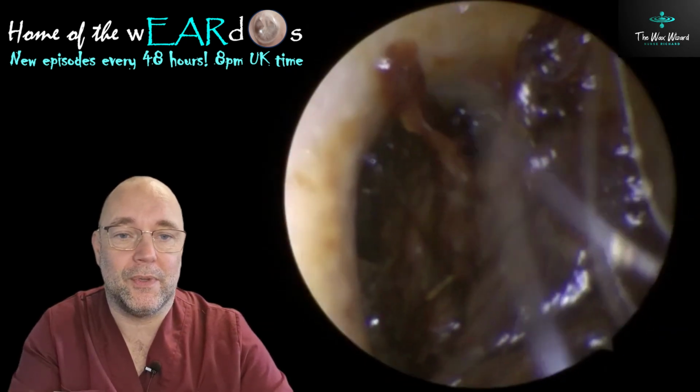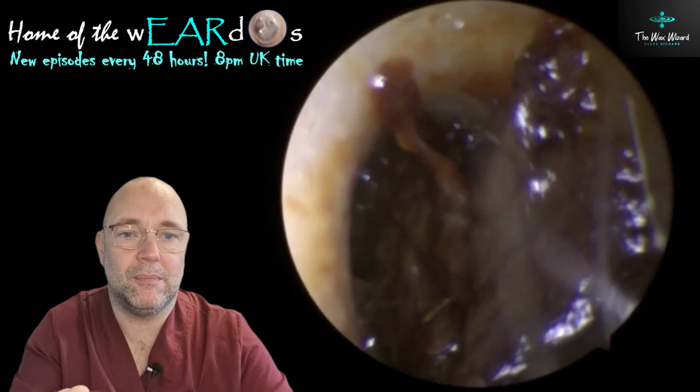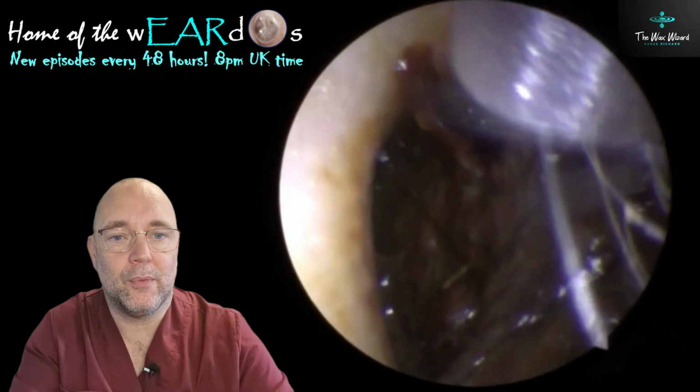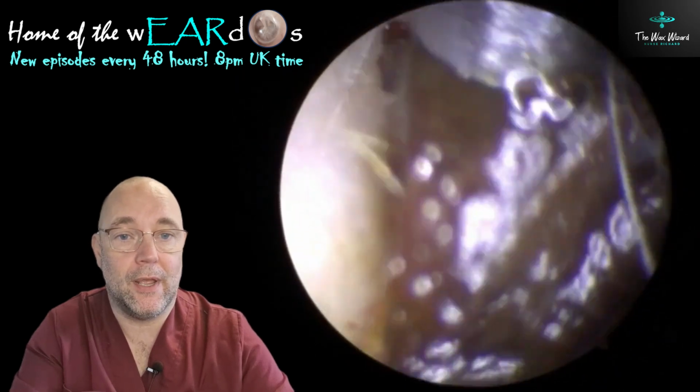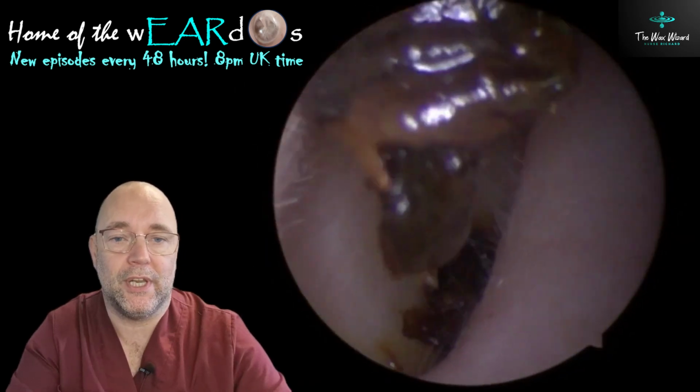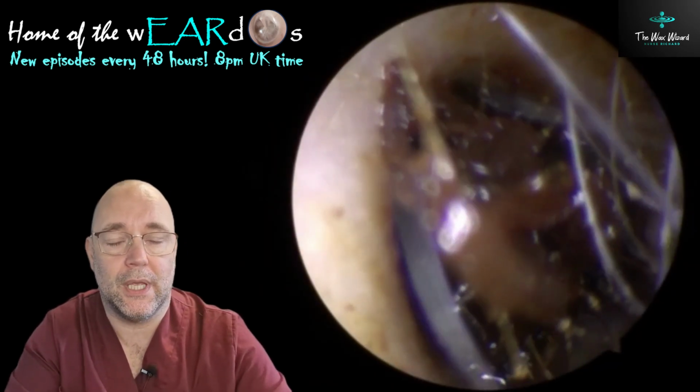Anyway, the first one, this lady came to see me. Extremely black, this stuff, and I thought it was going to be a nightmare. But it was surprisingly soft, considering how black it was. She'd done a fair old job of softening it. I think she's had some quite aggressive softening drops in there.